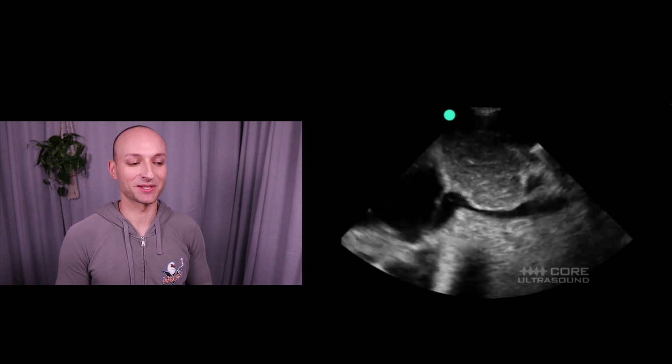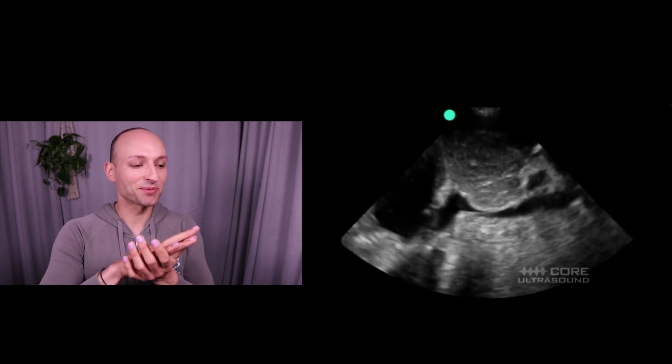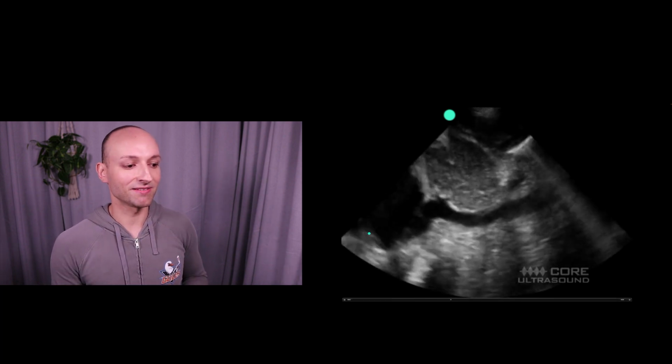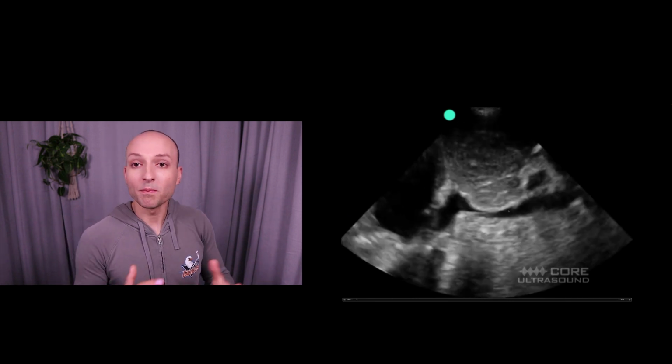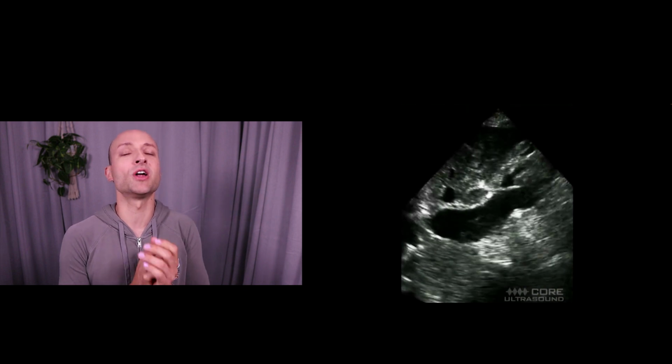Sometimes you don't really need to do any kind of calculations. I mean, let's look at this guy. It's tiny, it's compressing 100%. This IVC is small, and this patient likely won't be harmed by fluids, might even benefit from fluids. We look at this guy right here, and it's just really plump. It's dilated. As the patient breathes, we have no changes in the diameter at all. This patient likely is not volume responsive, right? Because it's big. We don't have to do any measurements of it.